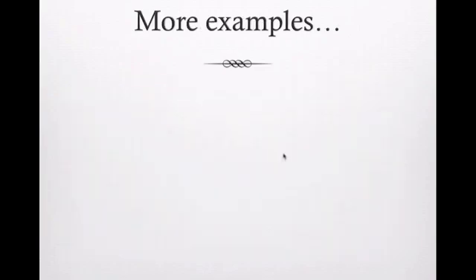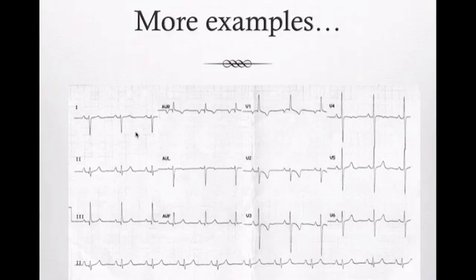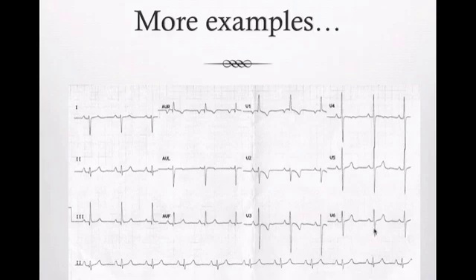Looking at another EKG: down-up-up again, criteria for right axis deviation. V1 is pointing up - thinking right bundle or right ventricular hypertrophy. There's a really tall R wave greater than 7 millimeters, tall S waves in V5 greater than 7 millimeters, and T wave inversion - this is a strain pattern. This is right ventricular hypertrophy with strain. Looking at lead two, there's a very big upward P wave greater than 2.5 millimeters - that's right atrial hypertrophy. So this patient's entire right heart is hypertrophic: right atrial hypertrophy and right ventricular hypertrophy on the EKG.